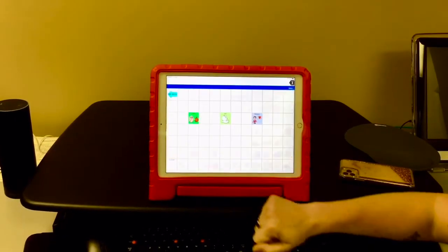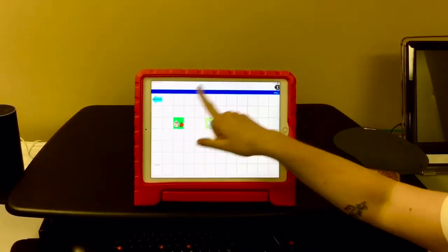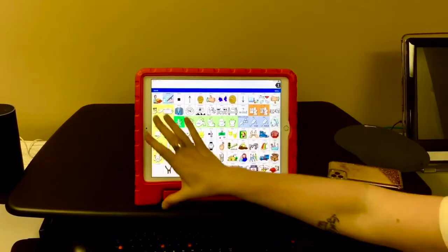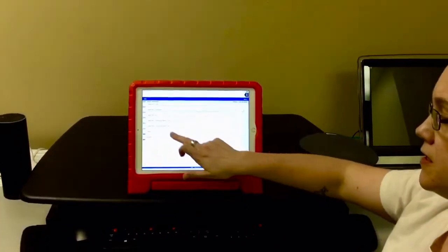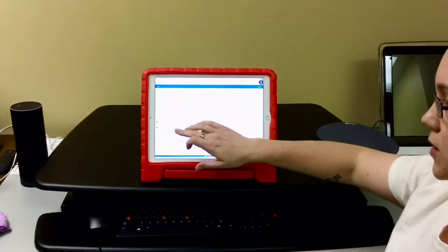So transition is going to open up, but you see I don't have all of my folders up here for Mexican, Italian, dairy. So we're working through levels. You can give the client this many words, or in the transition level, this many words. Or in the full version, there's somewhere between 7,000 and 10,000 words.